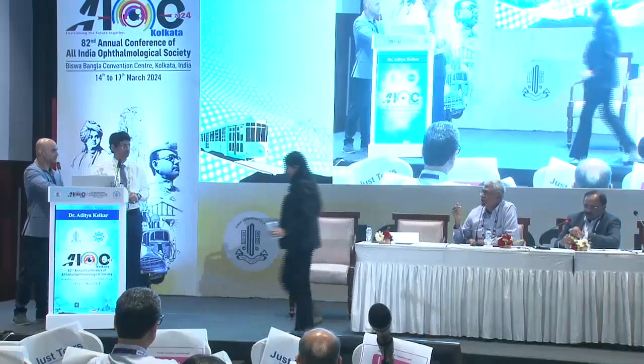And the surface of the membrane, is it a freshly harvested amniotic or a dried one? The cryopreserved. Cryopreserved. Okay. And the surface probably doesn't matter, right? Yeah, surface doesn't matter. Otherwise, maybe that would have explained why it crumpled. If it was a fresh membrane, I don't understand why it crumpled. So it was actually a tug of war between the normal retina and your amniotic membrane, probably.